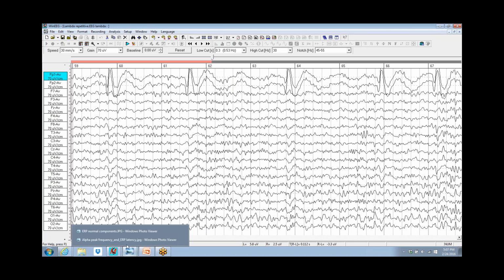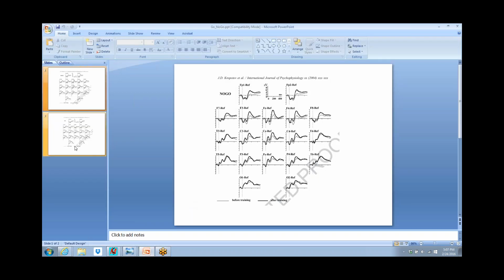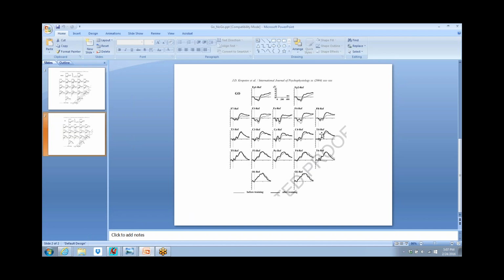Now, the responses to these stimuli end up being easily visible. These are go, no-go potentials. And this is essentially a continuous performance task with 100 performances averaged together. So the EEG averages out, and the response to the stimuli actually averages up.